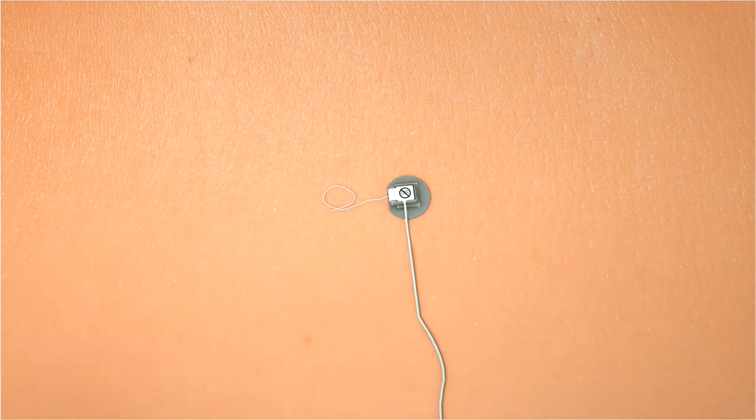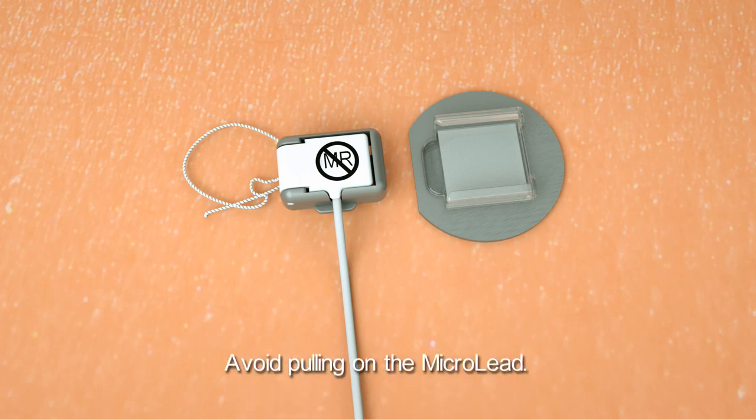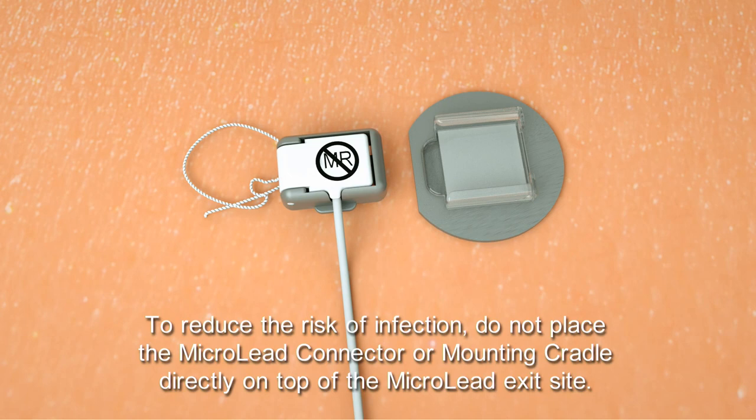If a cradle needs to be replaced, slide the MicroLead connector out of the cradle. Avoid pulling on the MicroLead as it exits the skin. Next, peel off the cradle and replace it with a new one. To reduce the risk of infection, do not place the MicroLead connector or mounting cradle directly on top of the MicroLead exit site.